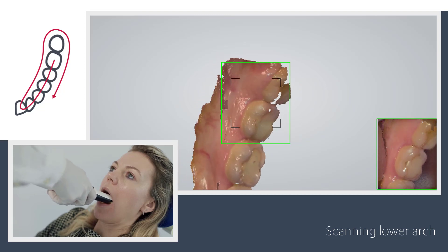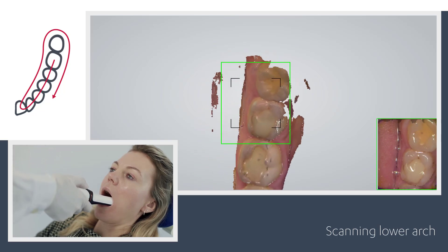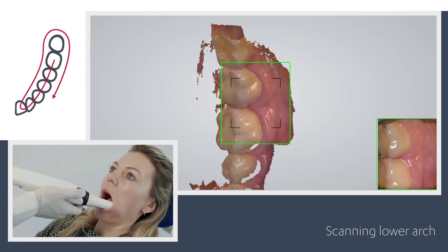Slowly roll over at the last molar going towards the buccal side. Scan the buccal side by moving mesial, and stop the scanning when the canine has been scanned.